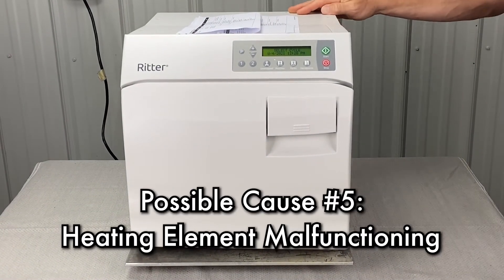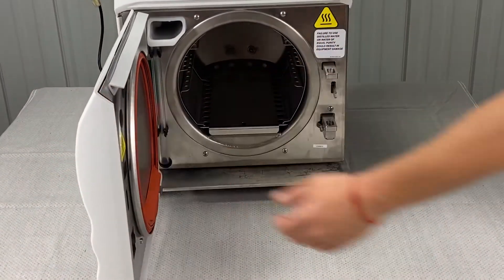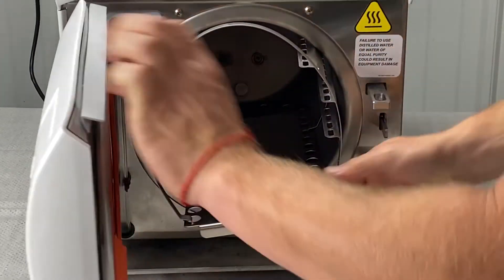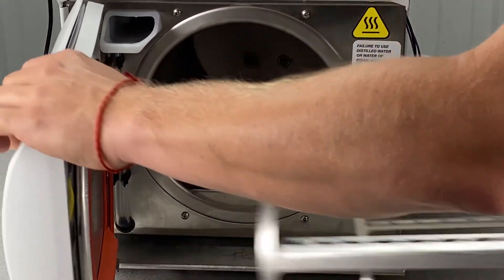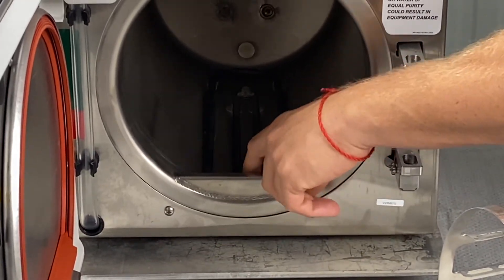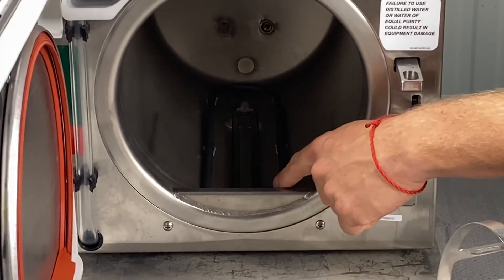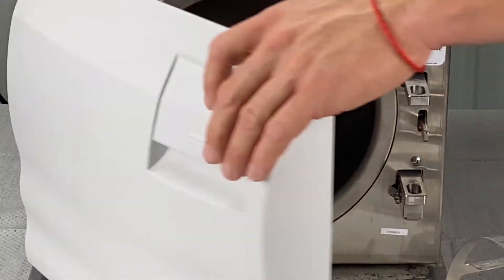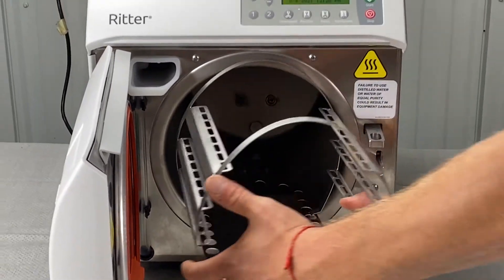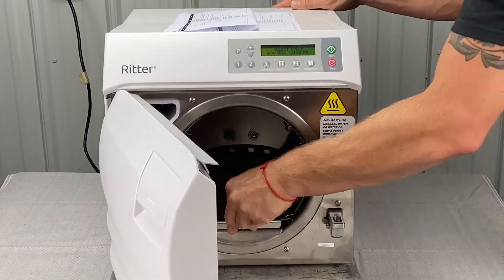The heater element could be malfunctioning. You can inspect the heating element during your weekly and monthly maintenance by pulling the tray out — the heating element is right here. Make sure there's no dirt in the bottom of the chamber, as that could actually be the heating element deteriorating and pitting. Beyond that, we would do a heater element relay output test — you'll need an inductive ammeter for that one.